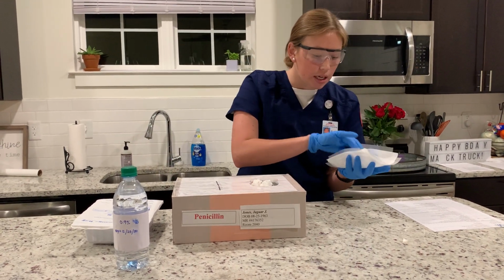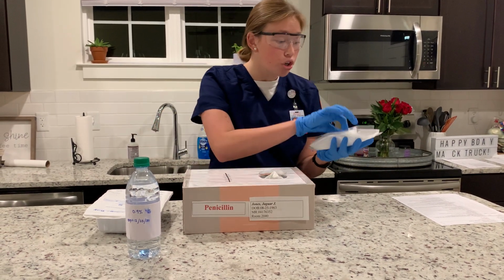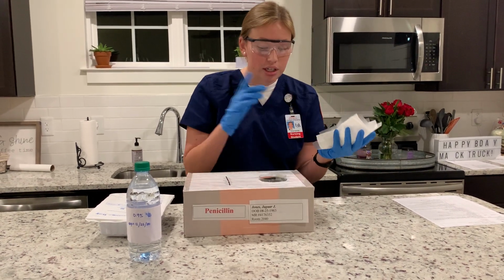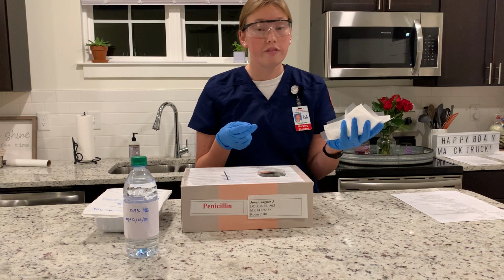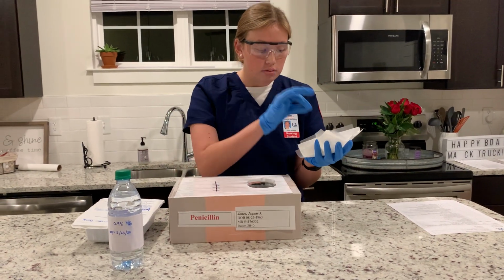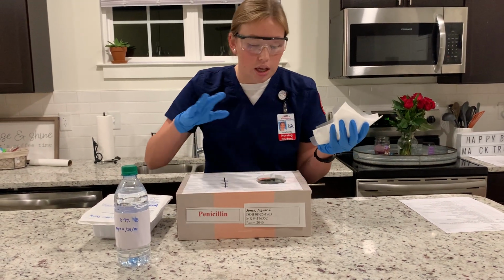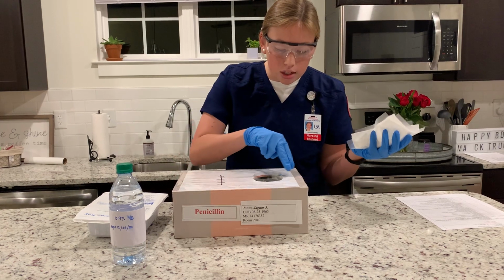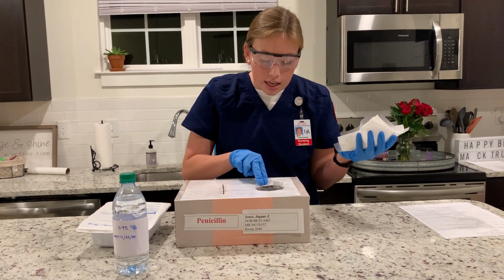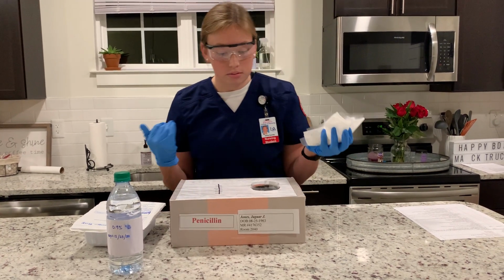And right now I will be assessing the wound, noting the size of the wound and looking for the tissue type: granulations, necrotic, or slough. I will also be looking for odor of the wound. When I take out the inner dressing, I'm going to make sure not to touch around the para-wound. And then I'm going to palpate around the para-wound on the exterior, noting any redness, edema, or any tenderness that the patient might report.